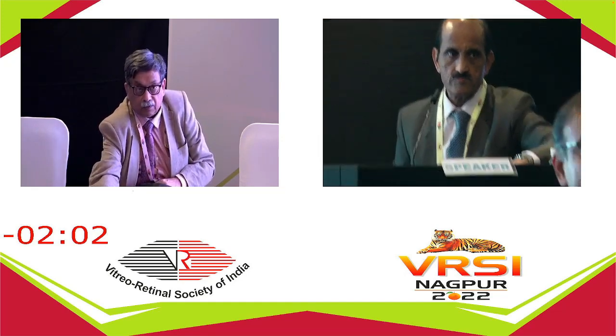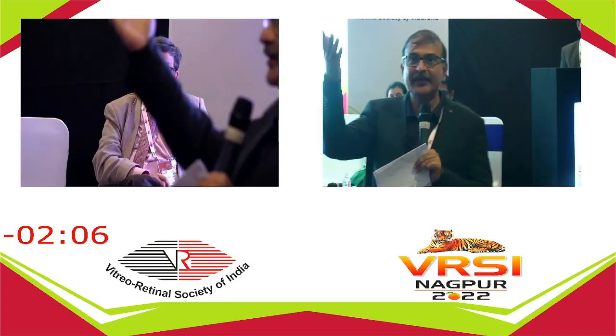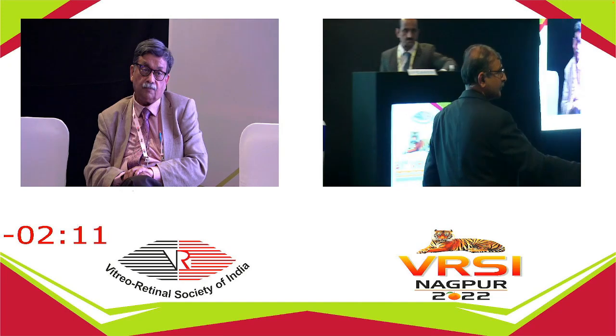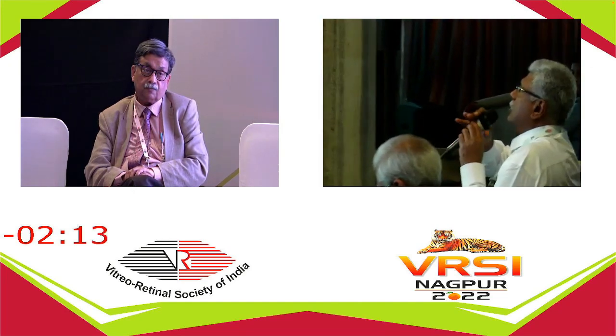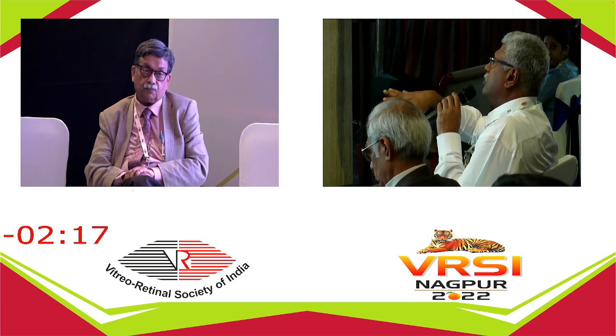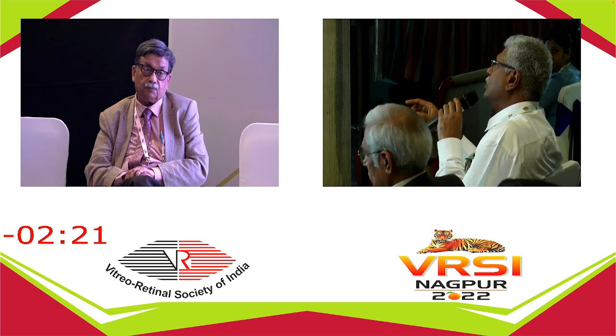Right. So amongst the audience, if anybody would have done anything differently, what would it be like? Second surgery, I would have probably left the perfluorocarbon as the tamponade, because the retina is contracted and we are unable to make intrinsic contraction. Then I would have left perfluorocarbon and then replaced it with silicone oil after about a couple of weeks.